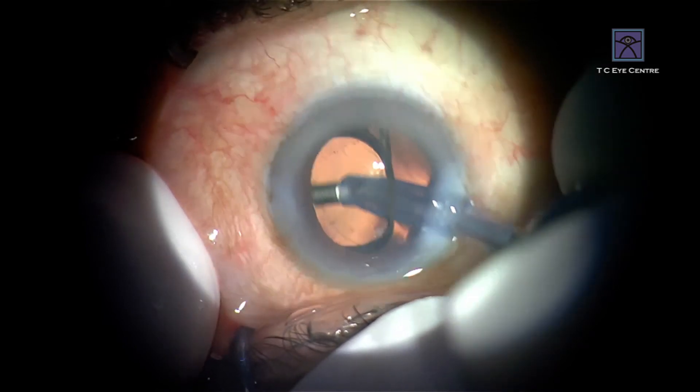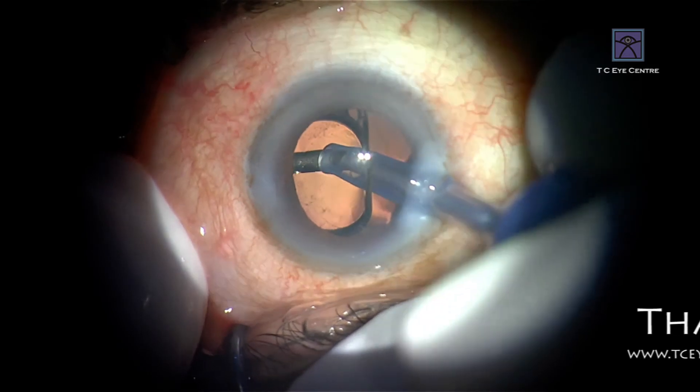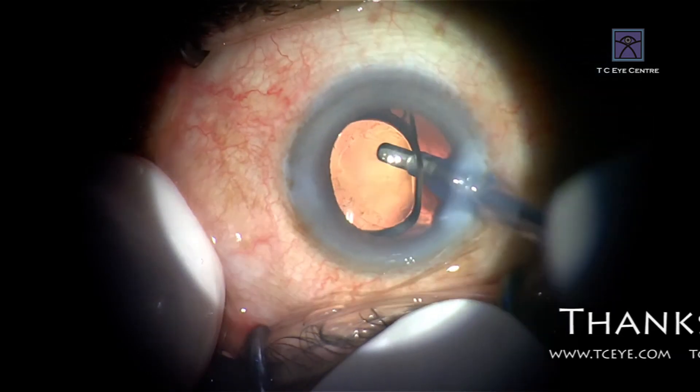And now you can go and clean the PCO capsule also. Find the polishing base you want to do. So let's go.